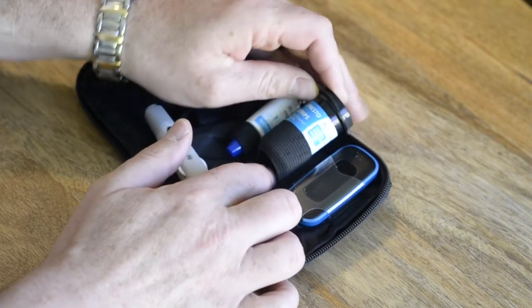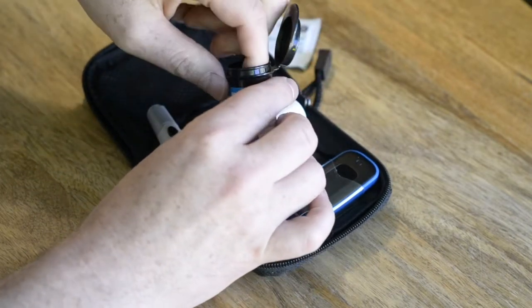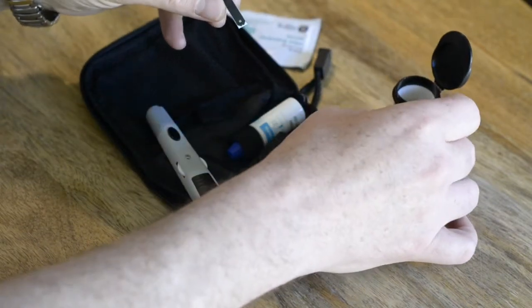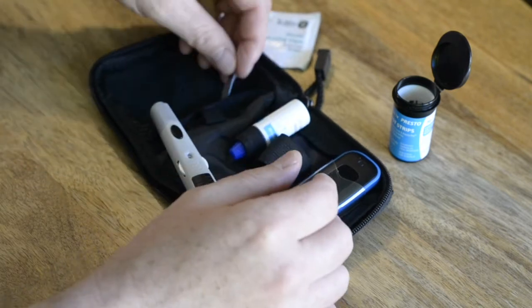Now let's get ready a clean new test strip. Keep this on hand, ready to insert into the device when instructed by the SmartMed app.